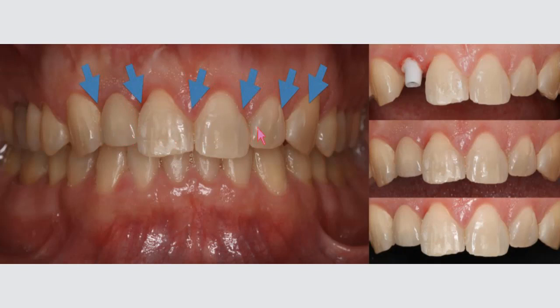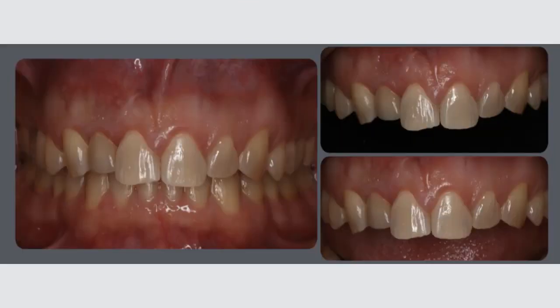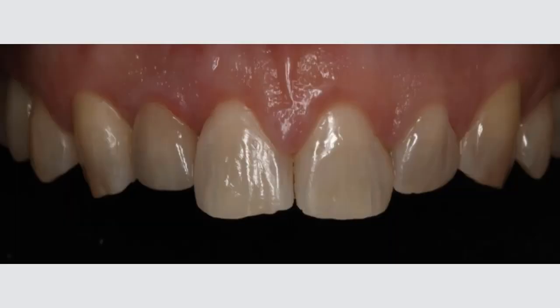And the patient did not want to change those composites. Remember that I have done a design, and I saw some lack of proportion on those teeth, but that's what he was looking for. No problem at all. So components in place, crown cemented, and then what I did was I polished all these composites, and I made some photographs of the composite being polished, and we can have some improvements without changing, and that's not what the patient was looking for.